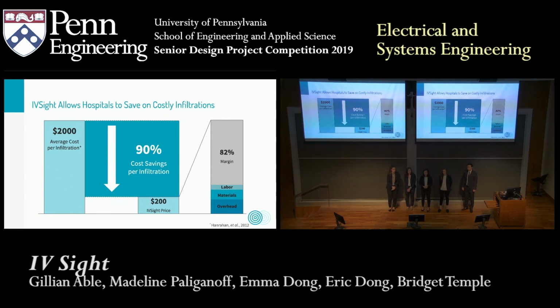And a follow up: you said it was Bluetooth enabled, but Bluetooth doesn't have enough range to get to the nurse's station. So it would be the nurse's station that's in the hospital room of the patient. So the one that's around 10 feet from the bedside.